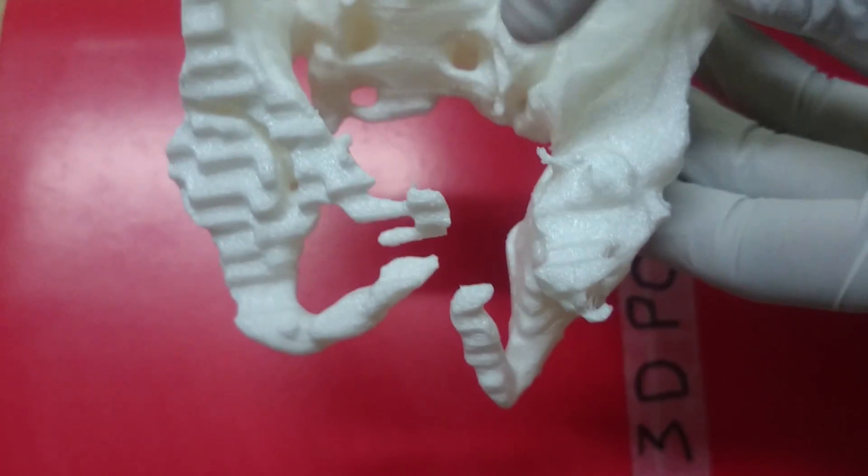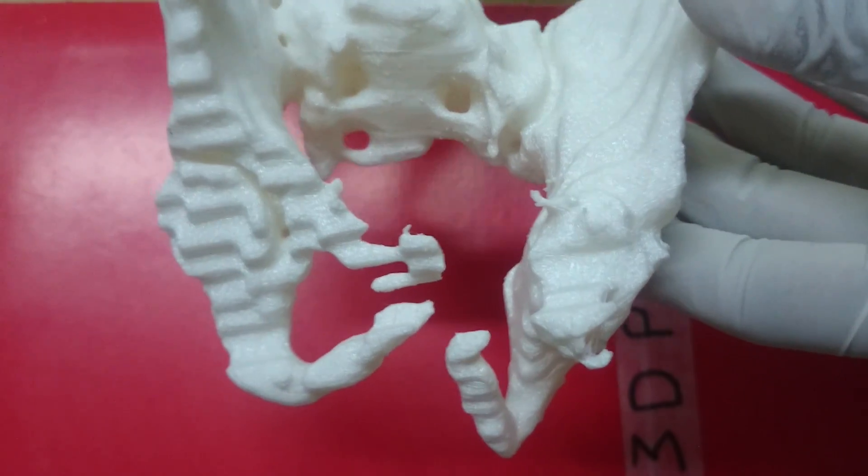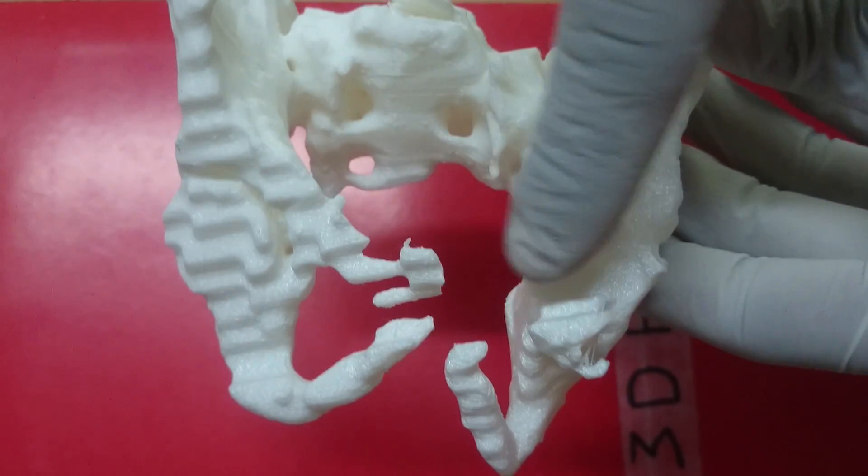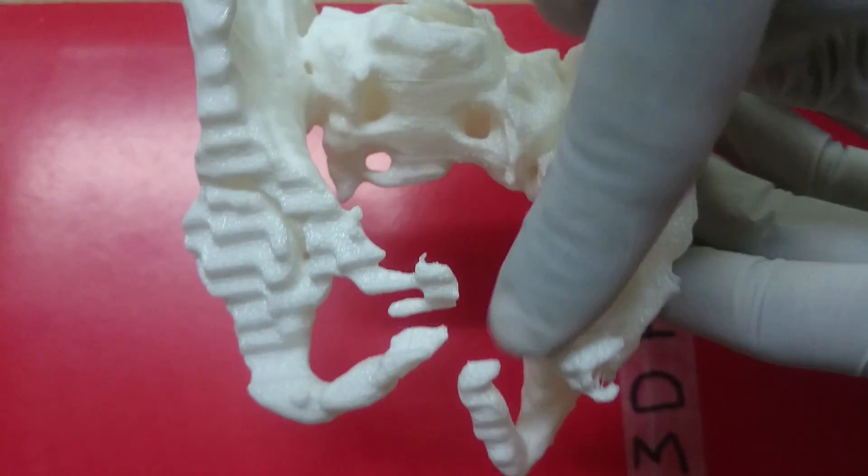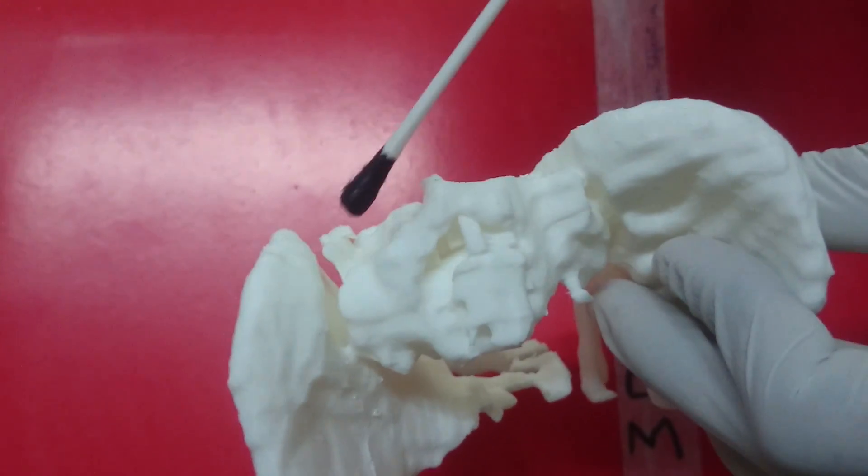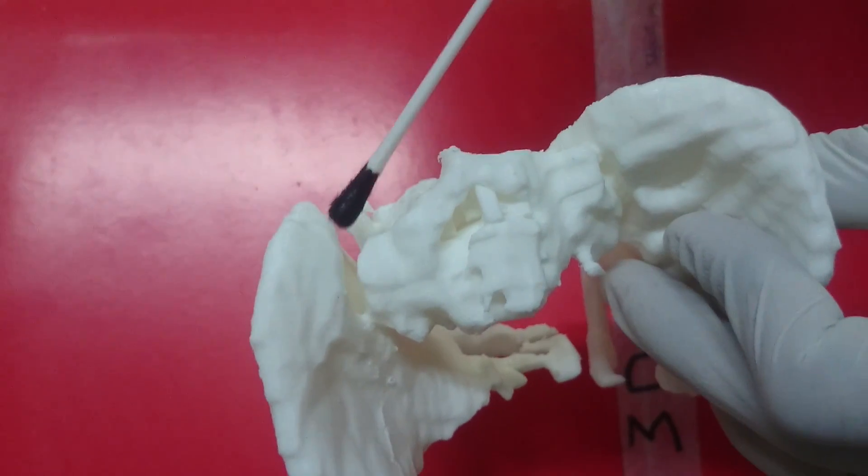You can have a look at the nature of injury that the boy suffered. It's an anterior posterior compression type of injury and there is a disruption of the pelvic ring, both anteriorly as well as posteriorly. You can have a look at how this posterior SI joint is disrupted on this side.